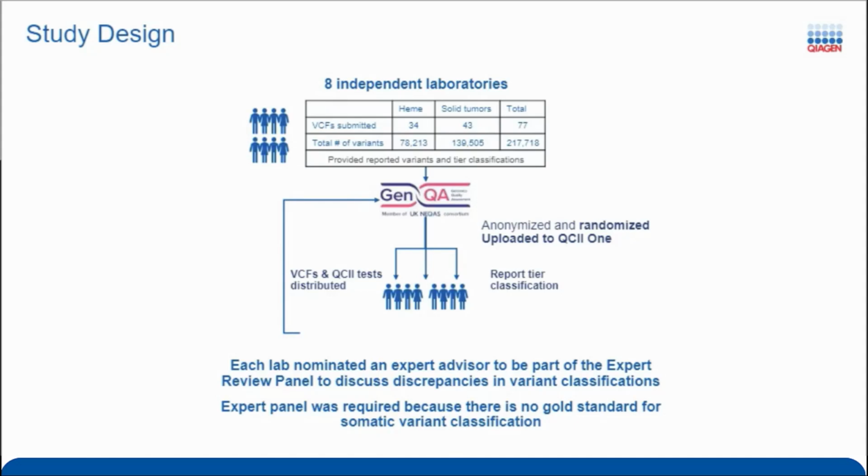Additionally, regarding the specificity of the entered diagnosis, we found during the study that if you entered an abbreviation, sometimes that could be misconstrued, and so the difference between myelofibrosis and mycosis fungoides led to a difference in tier assessment. That has since been addressed, but we didn't consider that to be an interpretation failing of the software either, because we're doing the interpretation within the context of the disease.